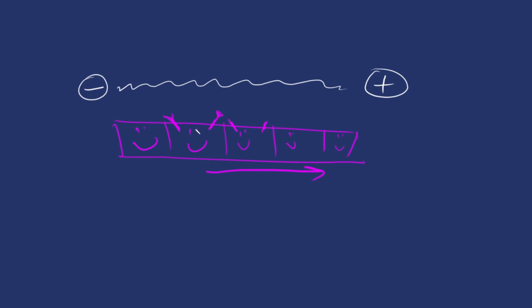Okay, so going this guy here to the next one to the next one and moving down, this creates a wave of depolarization as these cells depolarize, and depending on the direction that this is moving is where we get our drawing onto the EKG. So if we're moving, in this case, from the negative towards the positive, okay, so if this wave of depolarization is moving towards the positive, we're going to have an upwards deflection, right?